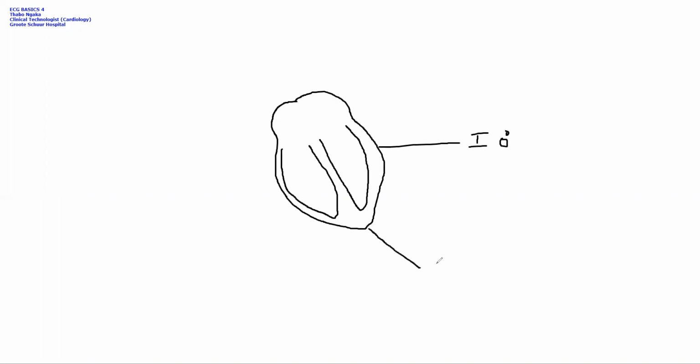We've got our lead 2, which is plus 60. Once you understand this, it's going to be so easy for you to determine cardiac axis. You will see minus 30.